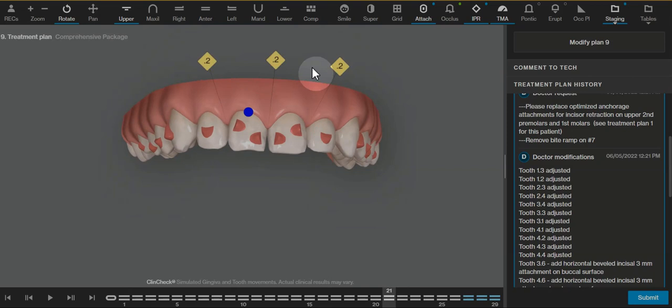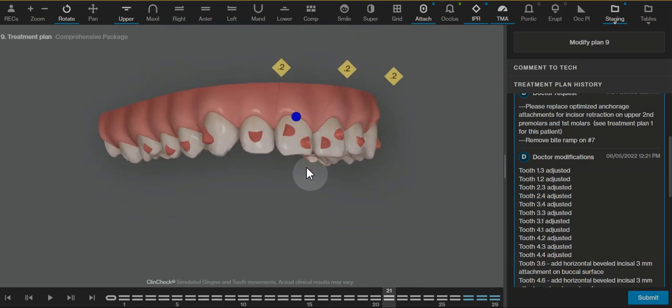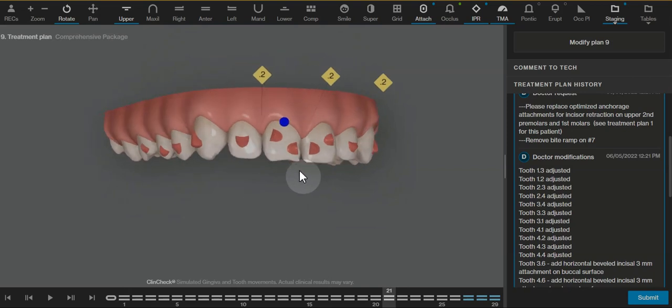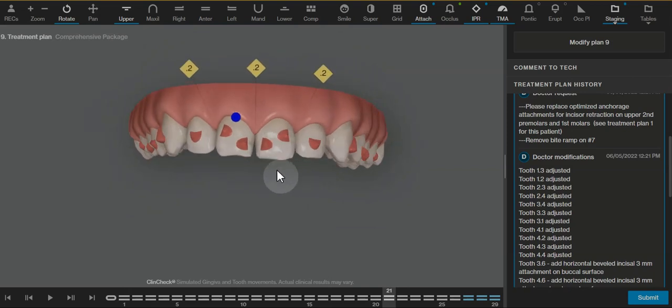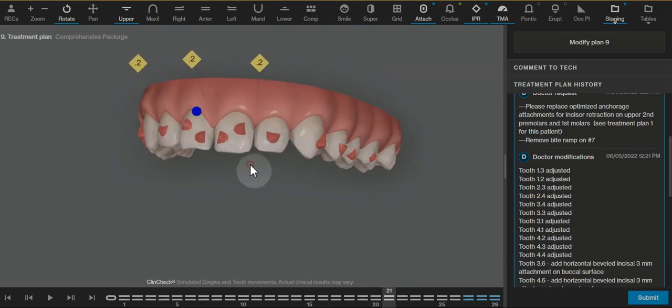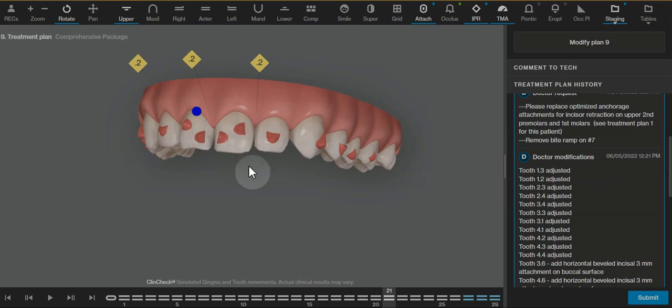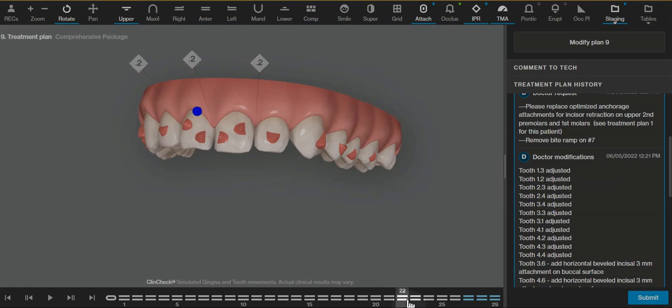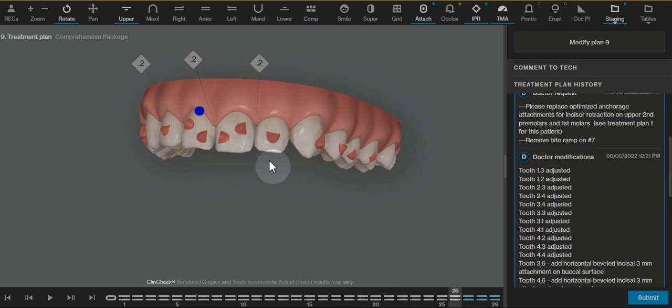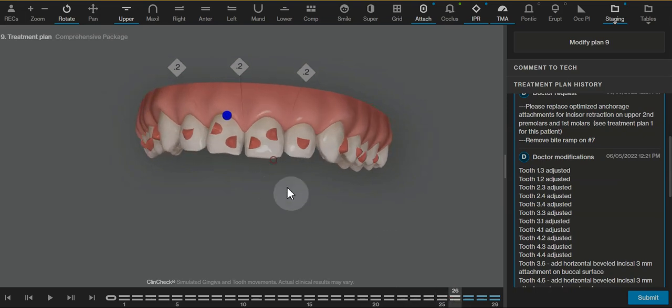The IPR on the upper arch is what we would call fake IPR. So I do this in small increments, and you'd find at aligner 21 that if you floss here, the teeth are likely to not be in contact and that's okay. You're going to leave them right where it is. Do not do the upper IPR and just allow those teeth in the aligner to push them tighter together so they end up with a nice contact.